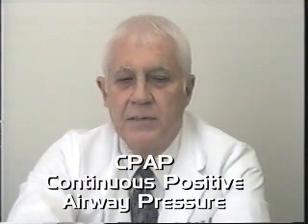Non-invasive positive pressure ventilation has become important in the management of respiratory insufficiency and respiratory failure, as techniques for improving the patient's dyspnea by this method have advanced. One of the major tools used in non-invasive positive pressure ventilation is the ventilatory mode known as continuous positive airway pressure, known as CPAP. CPAP is known to lessen dyspnea by improving pathophysiology in two general areas, pulmonary mechanics and hemodynamics.